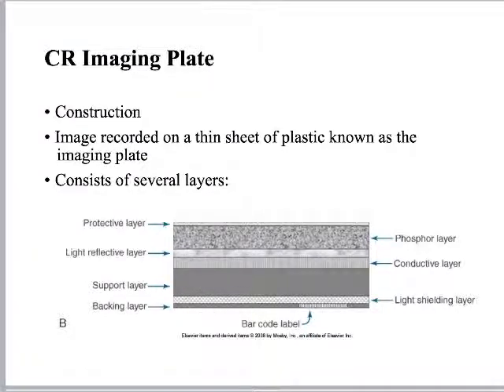So if we were to take that X-ray photostimulable phosphor plate, and the short term for it is PSP, right? If you take the PSP and you sliced it like a loaf of bread, and you looked at what's in the middle of it, you'd have a bunch of little stuff in between those layers. And it's important stuff. On the outside you have a protective layer. That's important, that it's got a protective layer around it. Because I don't know exactly what barium fluorohalide is, but it doesn't sound like anything I want to get in my mouth. It sounds like it could be a problem if I ingest something like that. So we've got a protective layer to protect both us and the material.